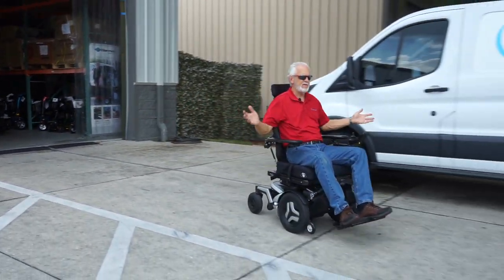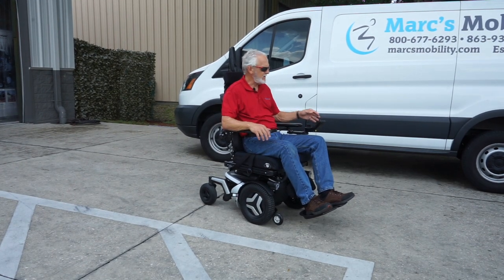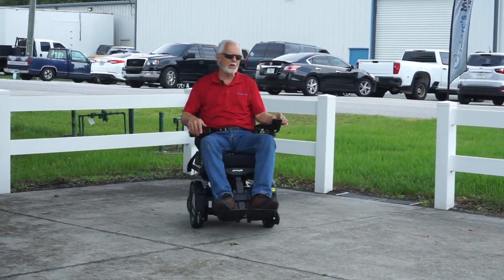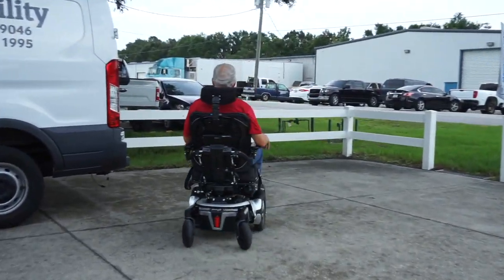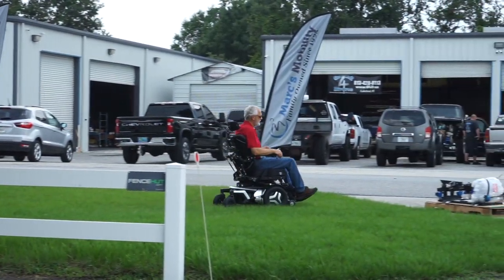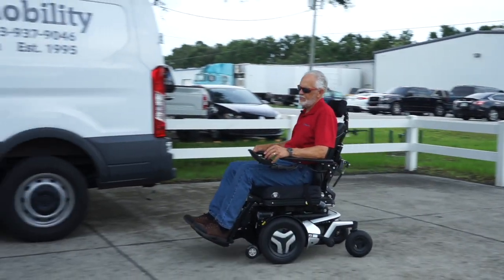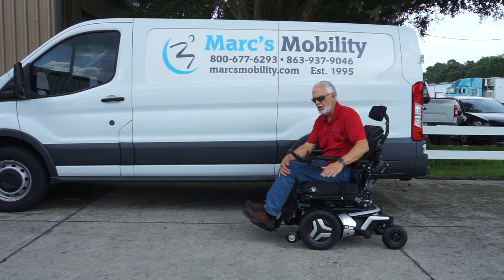When you stop, it stops automatically. The top speed is about 6.1 miles per hour. When you drive one of these you can tell the quality by the turning, the suspension, and the way it handles bumps. Super nice chair. No problem in the grass because it's front wheel drive — as long as your yard has a good firm bottom, you're fine.